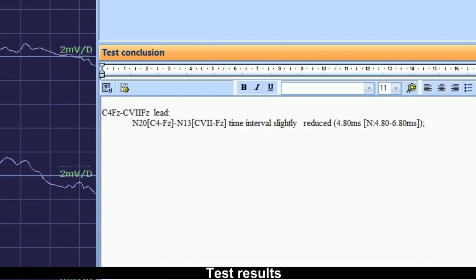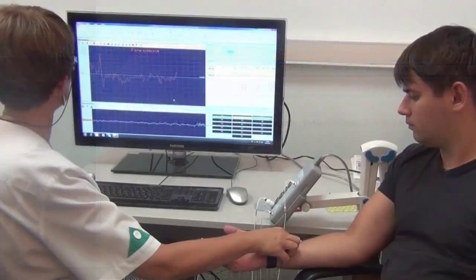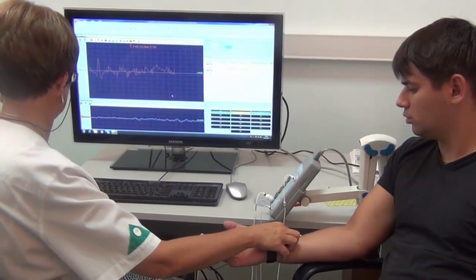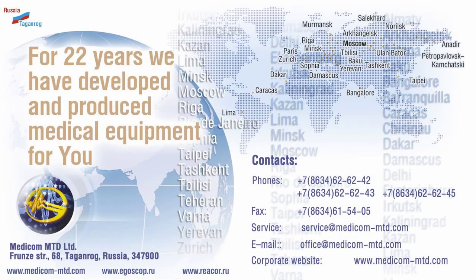Present-day development of electronics and wireless technologies provides quality recording of myographic signals and evoked potentials and guarantees comfort for a doctor during the studies carried out.